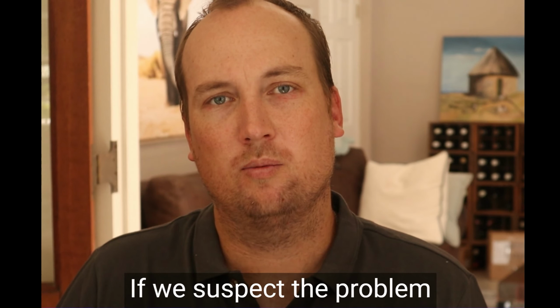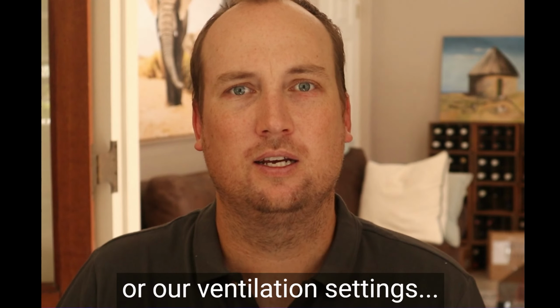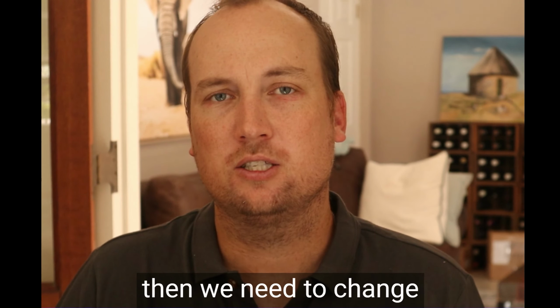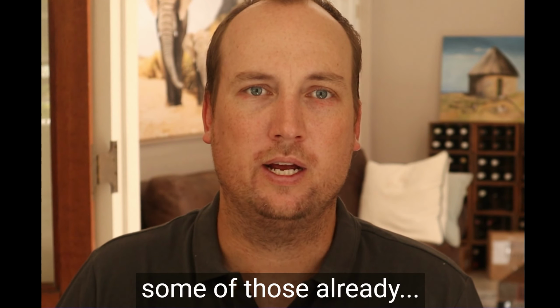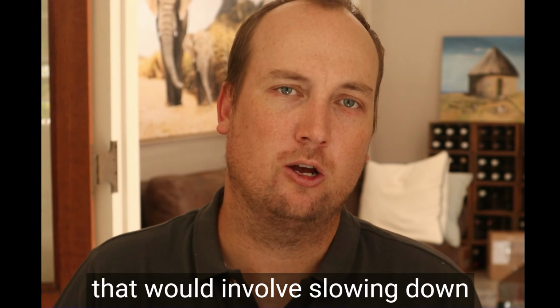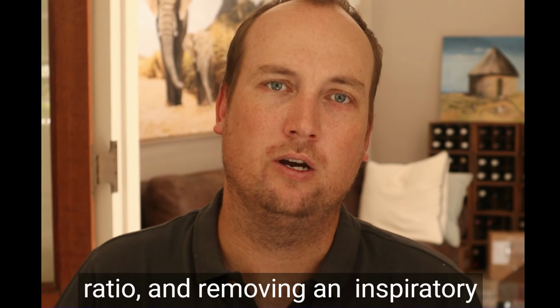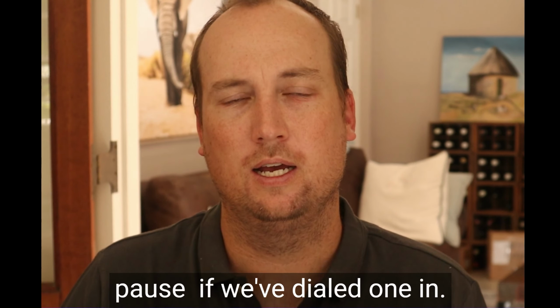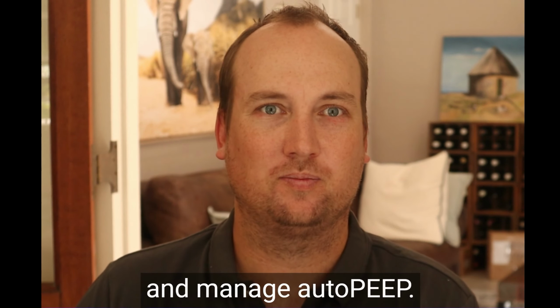If we suspect the problem is with our ventilation mode or our ventilator settings, then we need to change the ventilator settings to increase our expiratory time. And I've gone through some of those already. That would involve slowing down the respiratory rate, increasing the IE ratio, and removing an inspiratory pause if we've dialed one in. So that's how I approach and manage auto-PEEP.